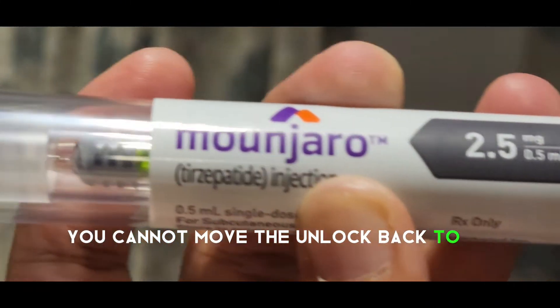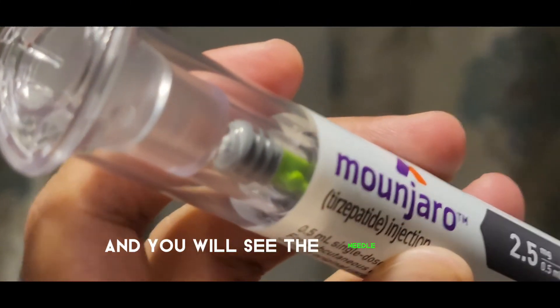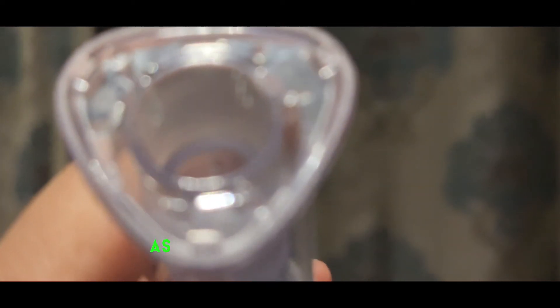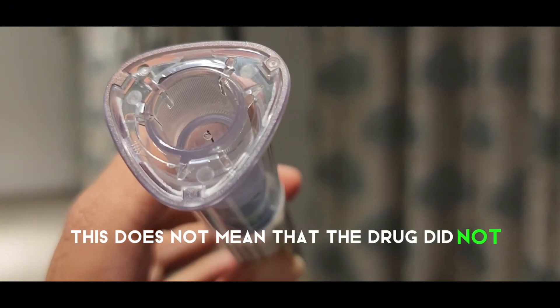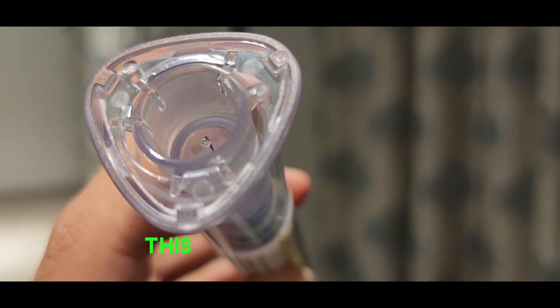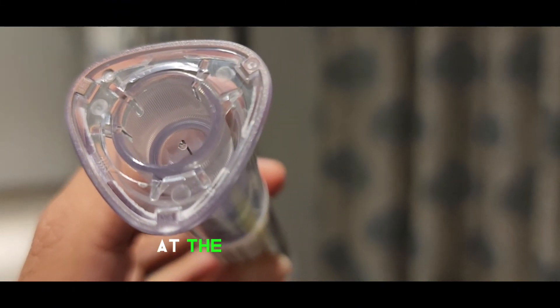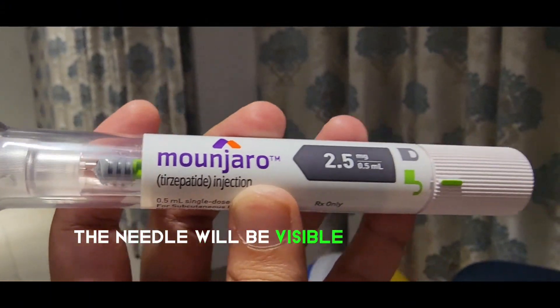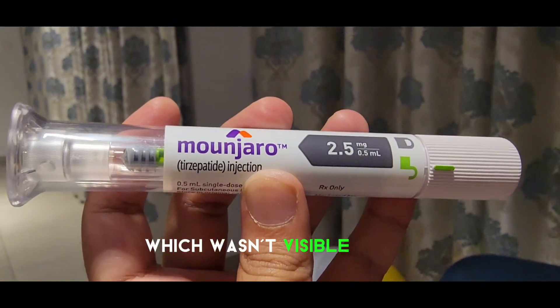At the end of injection, you cannot move the unlock back to the lock sign, and you will see the needle visible from inside. There can be an occasional drop of drug visible there, as you can see in the video. This does not mean that the drug did not go in the proper place — this is just residual drug at the end of the needle. The needle will be visible on the side of the pen, which wasn't visible before.